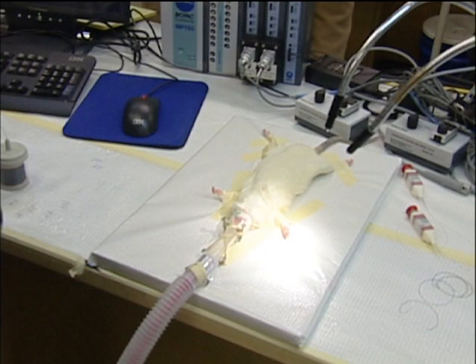To begin the experiment, Dr. Lee sets up the equipment. This is the source of light.